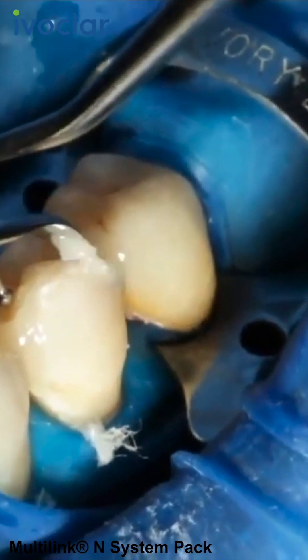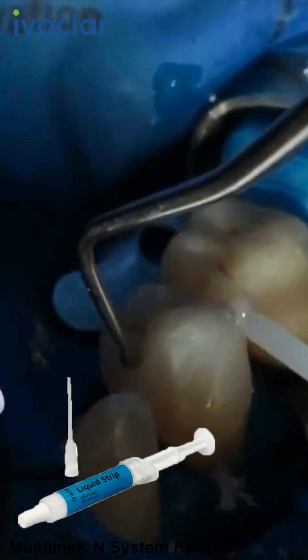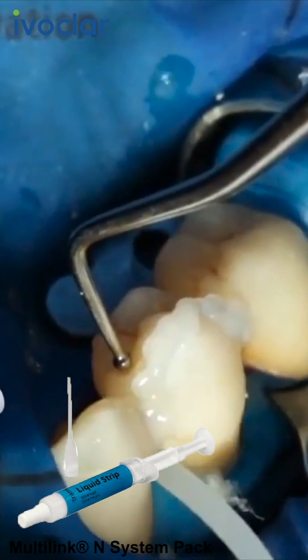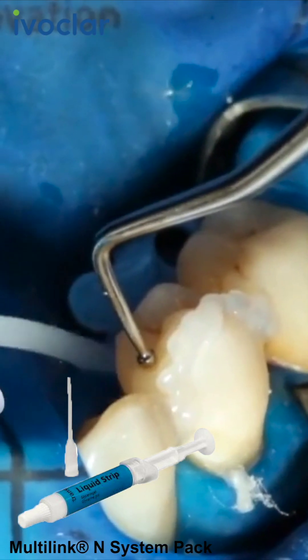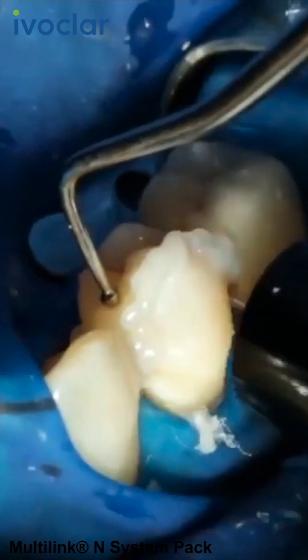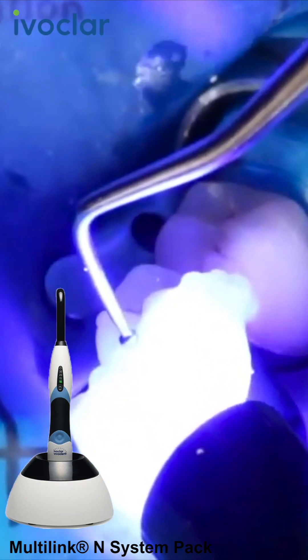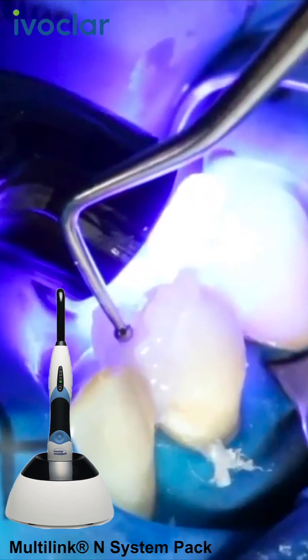Like all composites, Multilink N is subject to oxygen inhibition. In order to avoid this effect, cover the restoration margins with glycerin gel or air block immediately after the removal of excess cement. Liquid Strip is particularly suitable for this purpose. Subsequently, light cure all cement margins for another 20 seconds using Blue Phase N in high power mode at a light intensity of 1,200 mW per square centimeter. If you have used impervious opaque restorative materials, wait for approximately 5 minutes until Multilink N is cured.